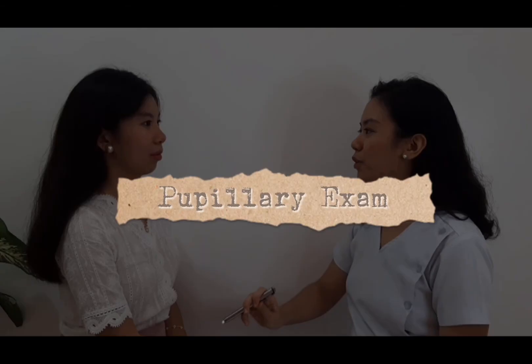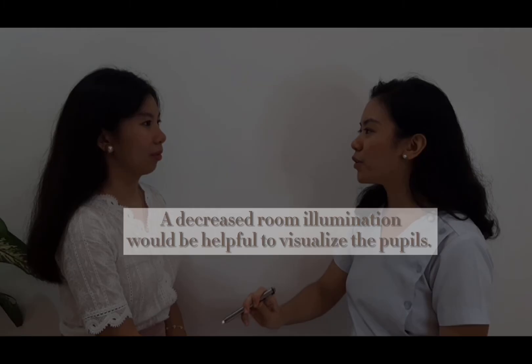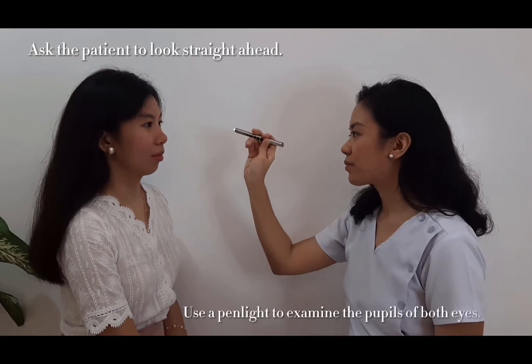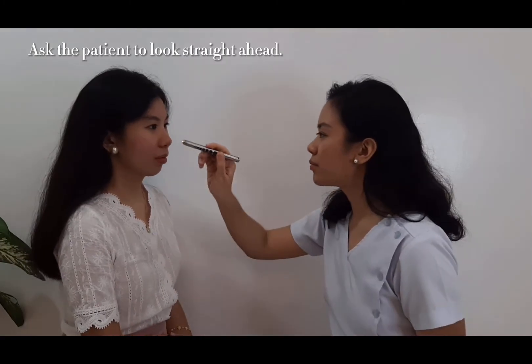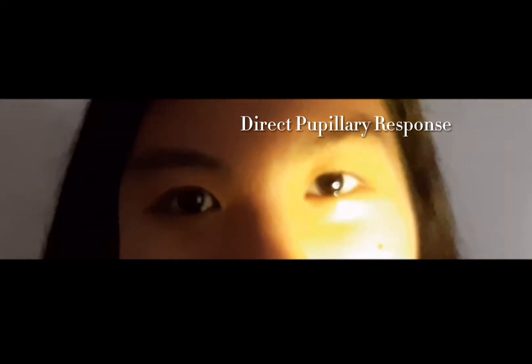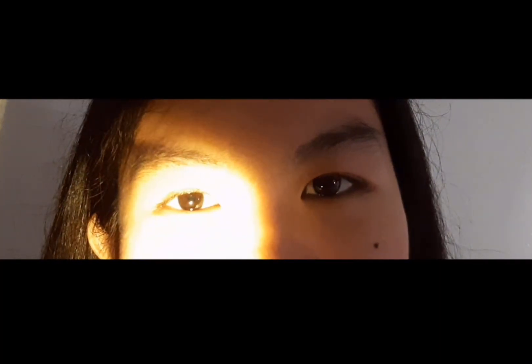The third part is the pupillary exam. A decreased room illumination would be helpful to visualize the pupils. Ask the patient to look straight ahead and use a penlight to examine the pupils of both eyes. The light can be shown directly into the eye by approaching from the side or from below. The direct pupillary response to light is recorded in terms of briskness of the response. Also observe the consensual reflex by noting the response of the non-illuminated pupil. Repeat all the steps for the opposite eye.